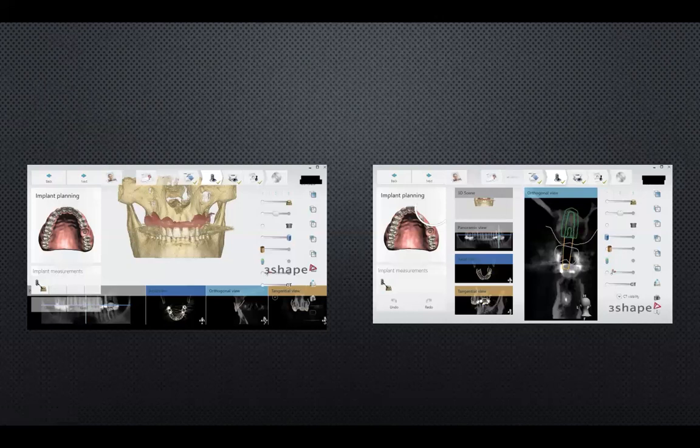So you can sometimes compromise some things to gain other things. For example, you can tilt your implant a little bit more lingually, so you will have more thickness of bone here on the buccal at the implant platform, or vice versa. So it's a nice interactive tool in the software, and it gives you a lot of liberty to move your implant and play with it until you're satisfied.